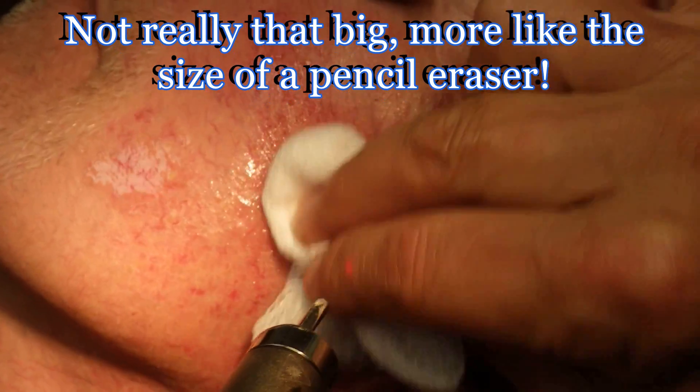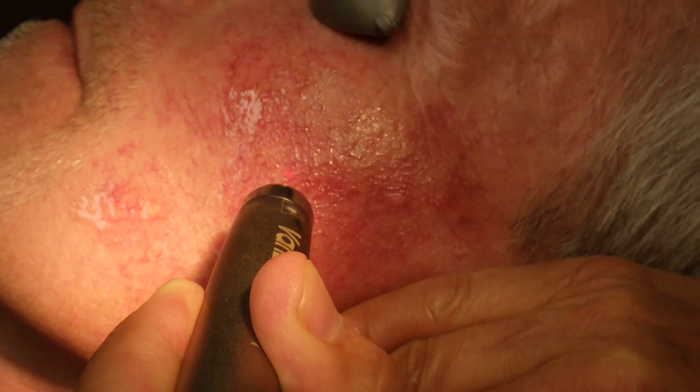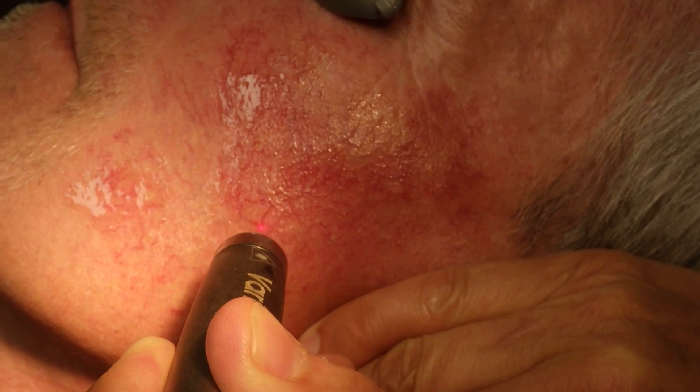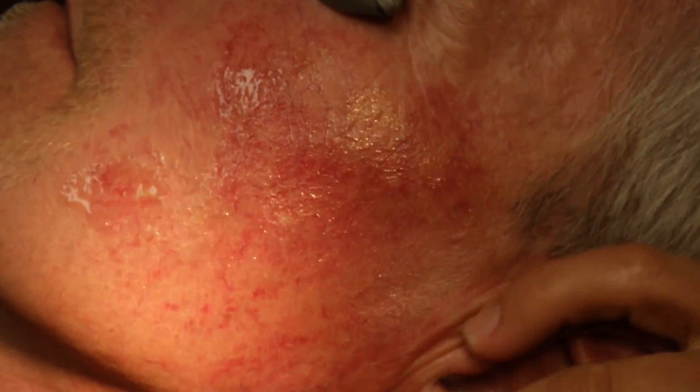These new solid-state lasers, like this Iridex laser, really represent new technology, and they're very useful for this type of treatment.